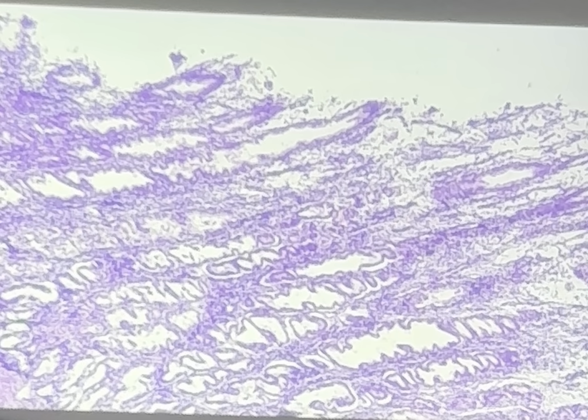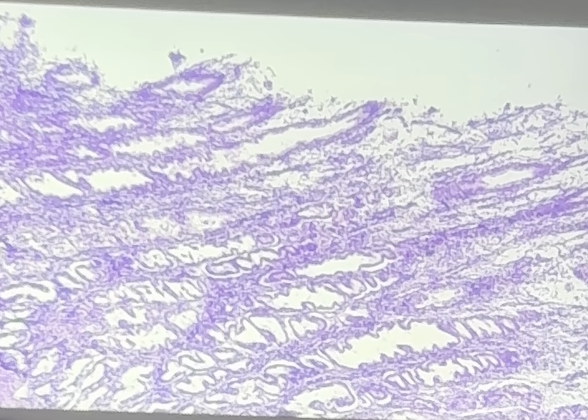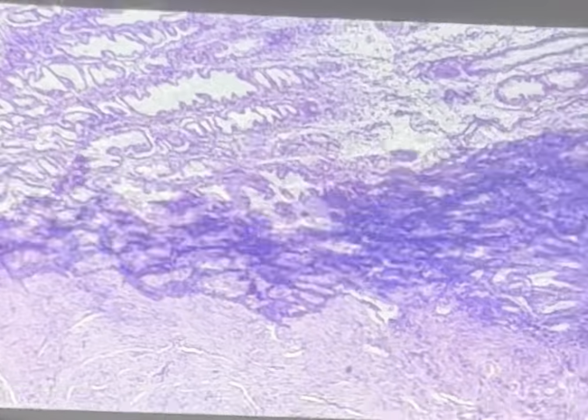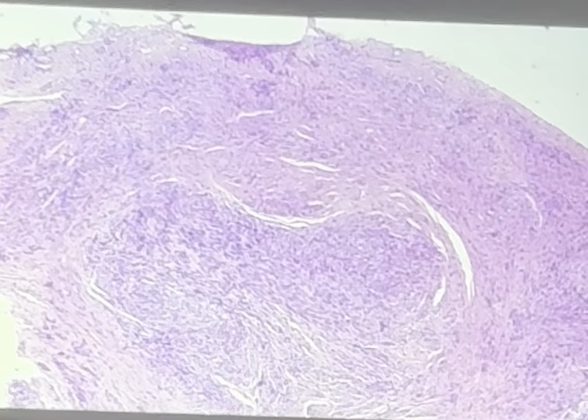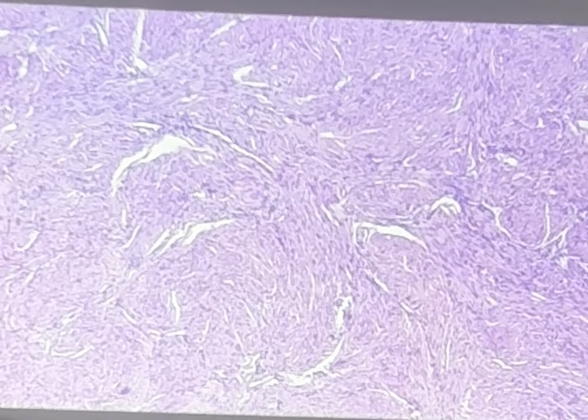I also got this after we finished the reproductive system, so I didn't show it to you in this one, because it's one of my newer slides. But again, the feature is another myoma here. See, it's forming a little one here on the left. This is a small myoma compared to the normal myometrium here.